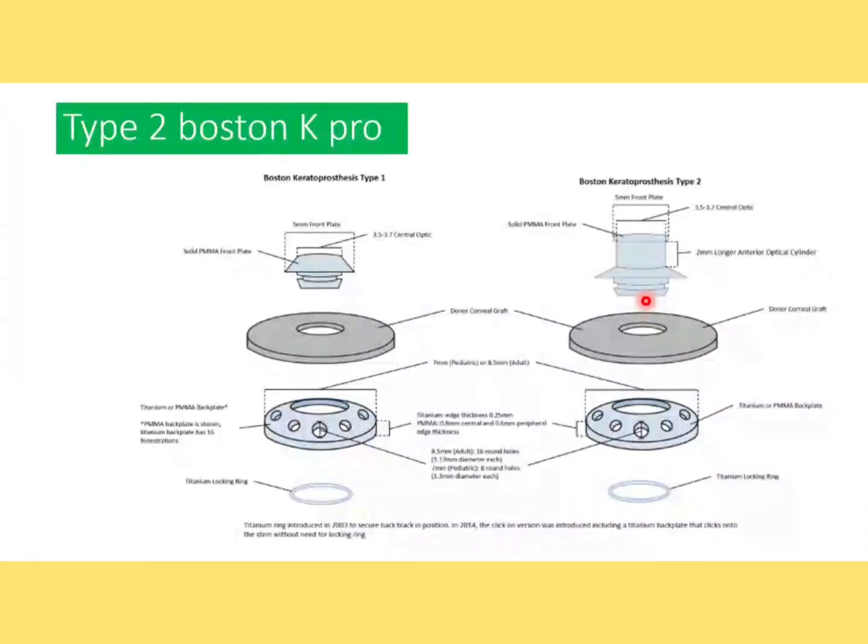Okay, so I was discussing with you all about type 1 Boston keratoprosthesis.